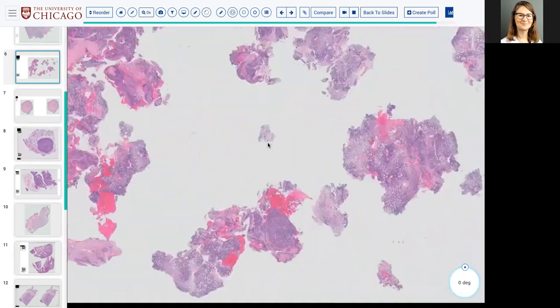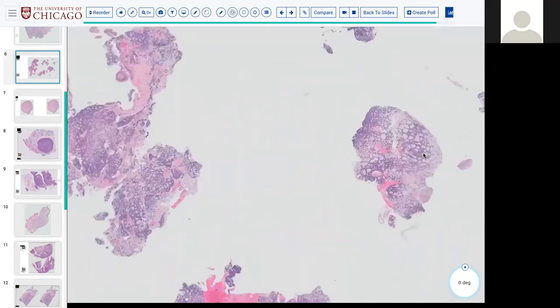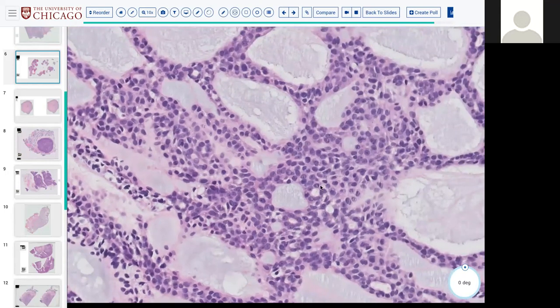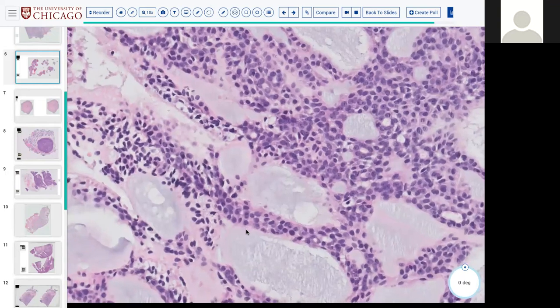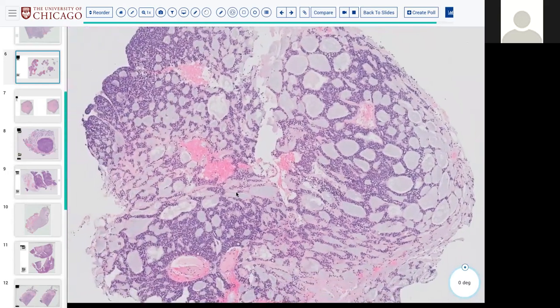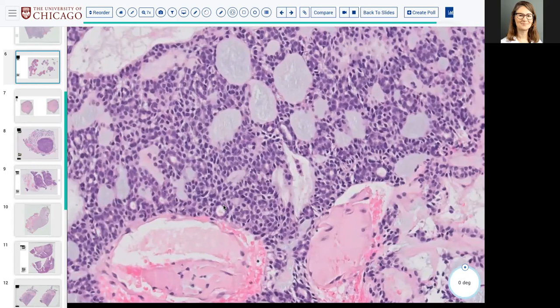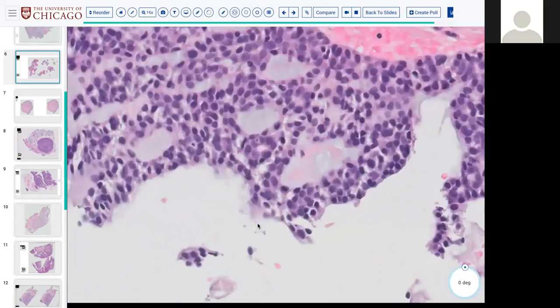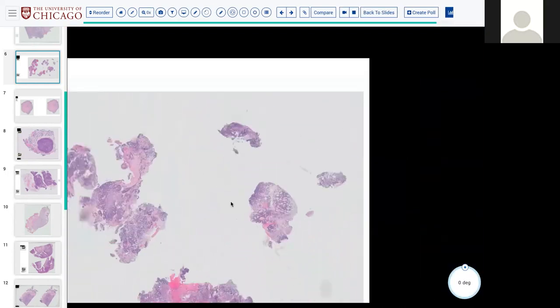Other comments on this one? I remember reading somewhere that the lumina in adenoid cystic are pseudolumina because they're all really connected, part of a single connected entity. Am I making this up? I don't think you're making it up. I don't think they communicate with a duct system, so in that regard they're dead end. They either are dead ends in and of themselves, or they communicate with each other in a three-dimensional tubular system. Is that what you're trying to say? Probably, yes. I just remember the word pseudolumina, and I didn't quite understand what that meant. So I guess that makes sense.